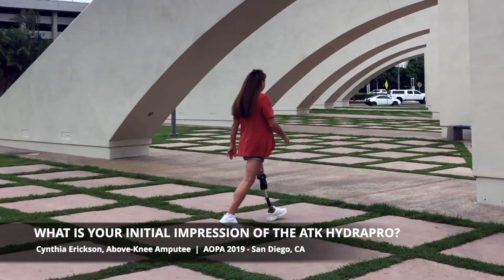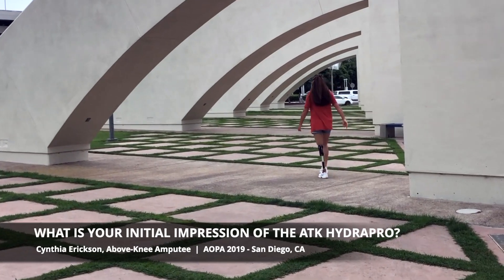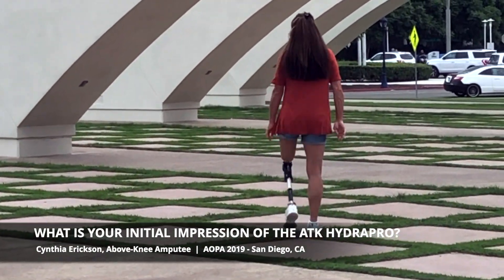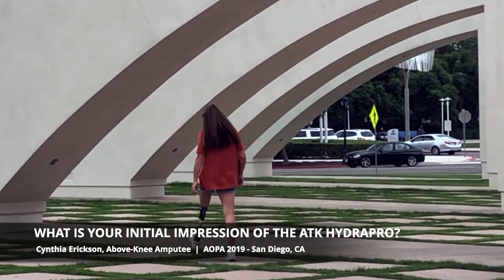So I feel very secure. I don't feel like I'm going to fall. I can walk backwards, I can sit down. I can walk around all day in it without wanting to switch it out into a sea leg or a microprocessor. And I'm very excited about it.